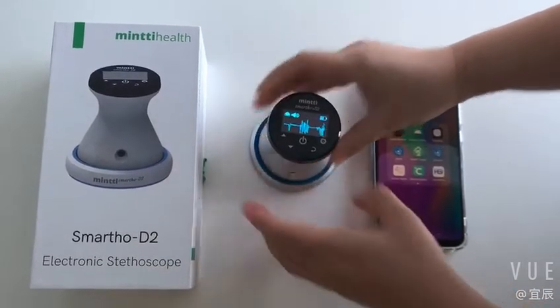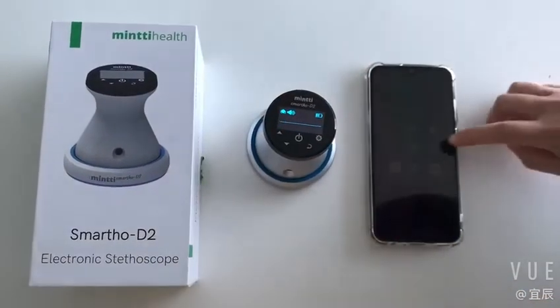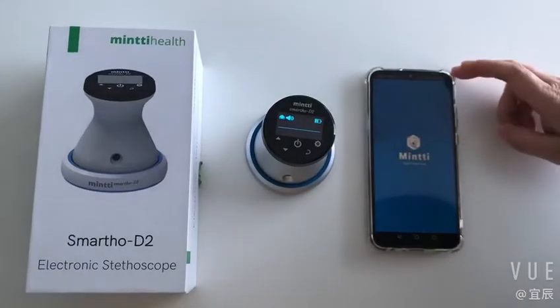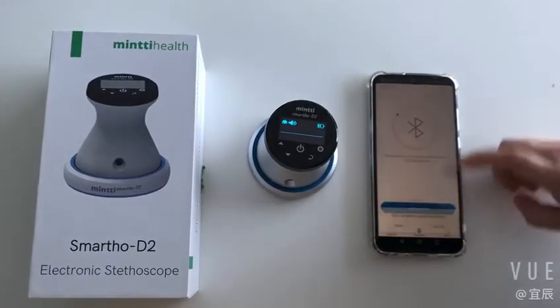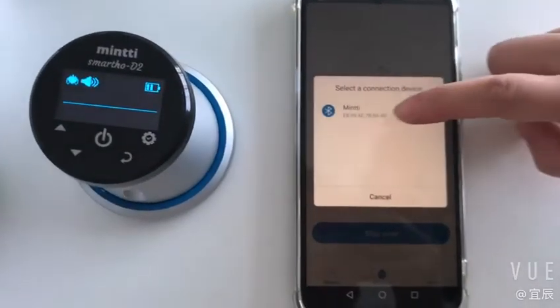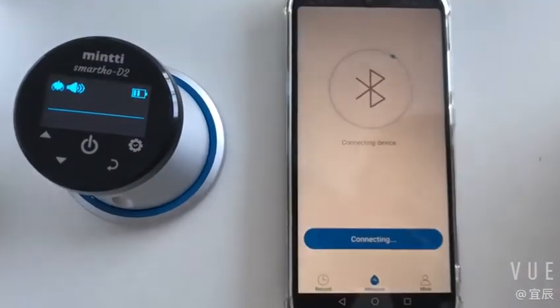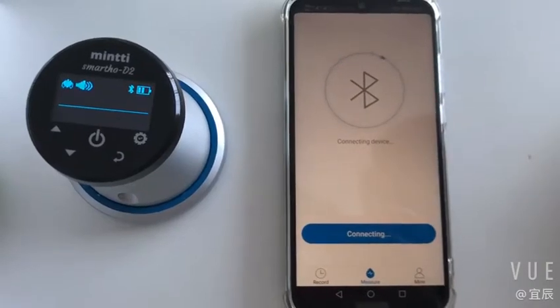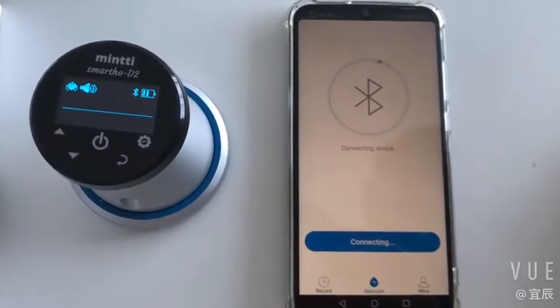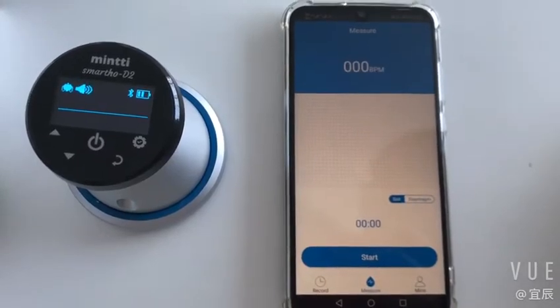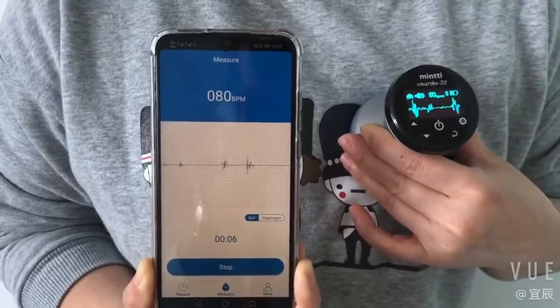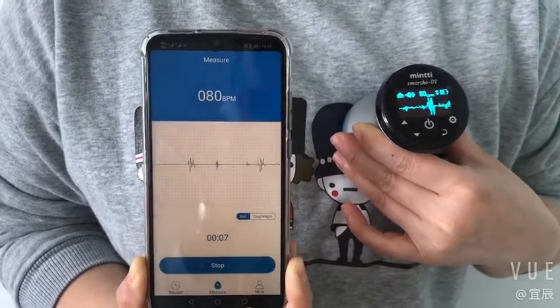Thank you for purchasing Minty electronic stethoscope. This product is used for monitoring the heart sound and lung sound of human body and can record signal data. The historic data can be viewed and played back at any time. Heart rates and other cardiopulmonary parameters can also be monitored and displayed.